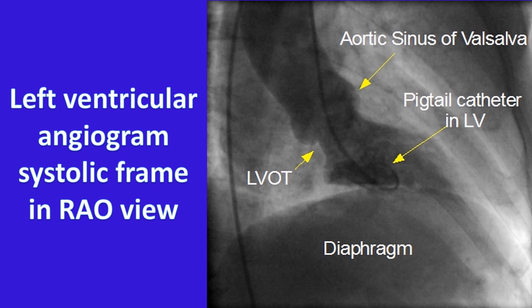The silhouette of the diaphragm is seen just below the cardiac shadow. Key abbreviations: LVOT refers to the left ventricular outflow tract; LV refers to the left ventricle; and RAO refers to the right anterior oblique view.